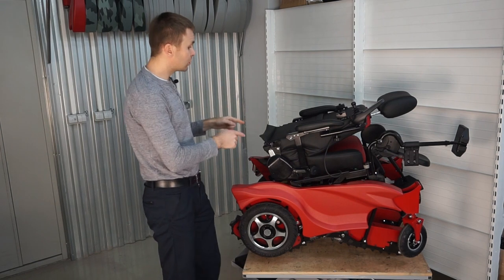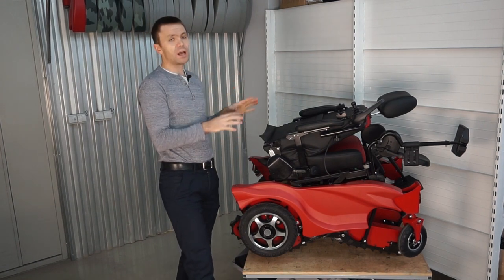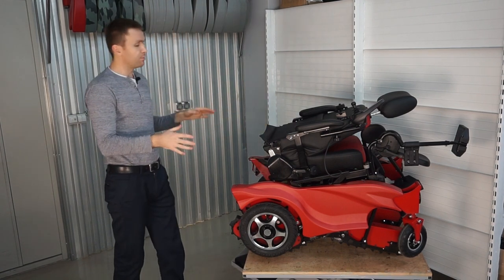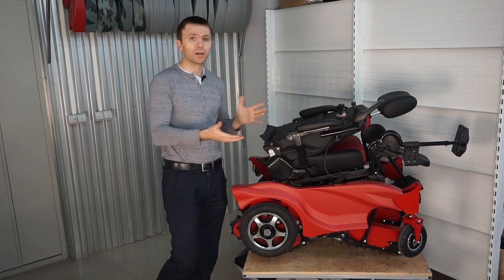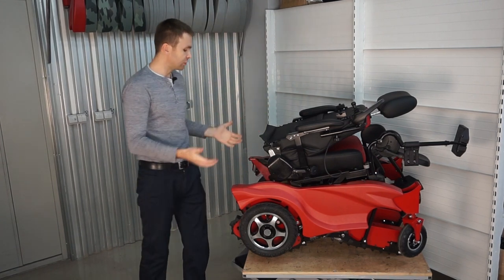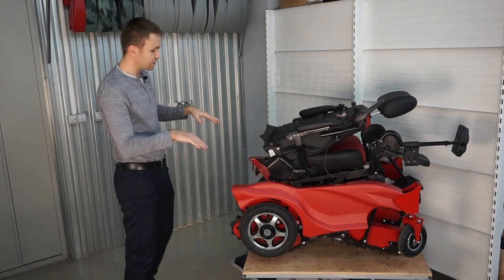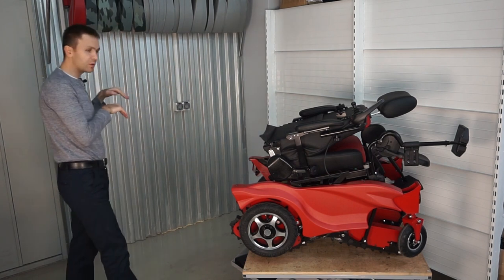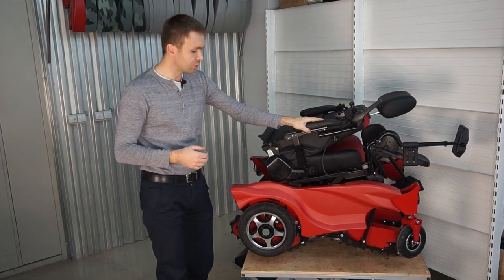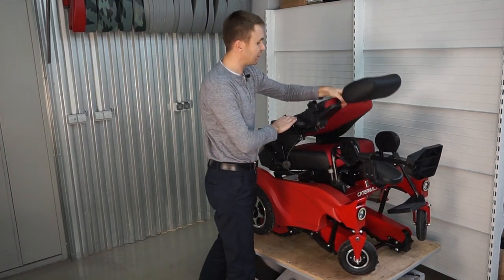At 70 cm height in transportation position, this wheelchair can fit in almost every CUV, as long as the trunk height is more than 70 cm. You don't even need to lift the wheelchair — you just place a ramp in your trunk and the wheelchair drives in by itself, so you can do it completely alone with no help needed.